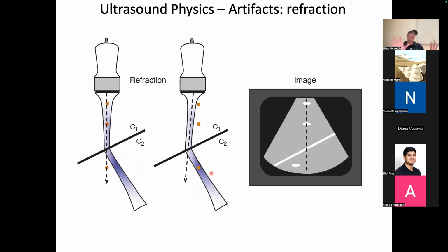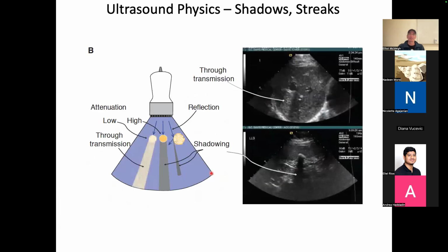When this is all mixed up, and it's very complicated and there are many interfaces and many different velocities, all of these artifacts start adding and start looking random. And so probably what it shows up as is just a crappy image, like things on top of each other, right? So it would be hard to do the inverse problem. In this case, it would be easy, but this is just to illustrate what's happening.